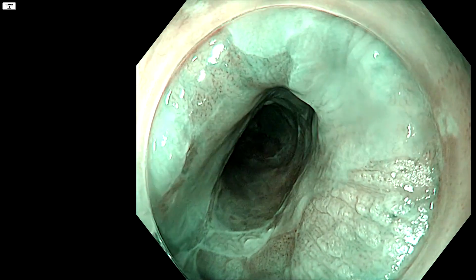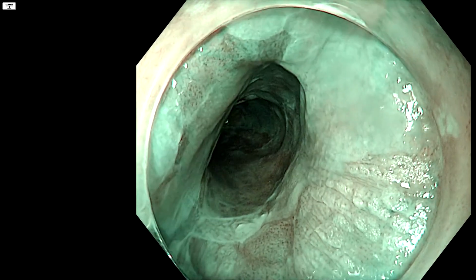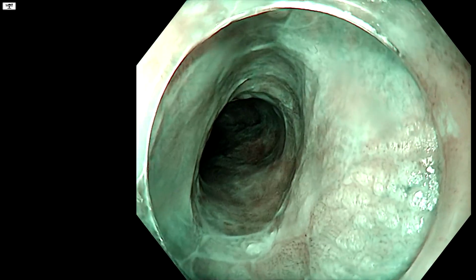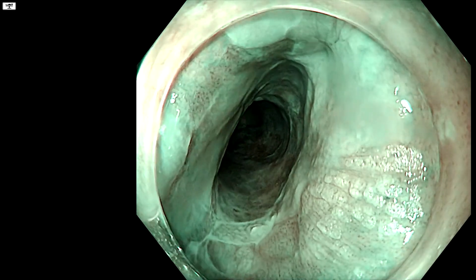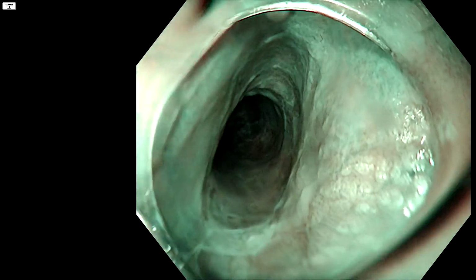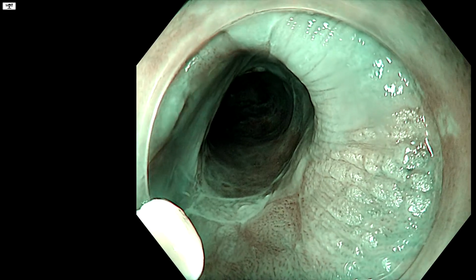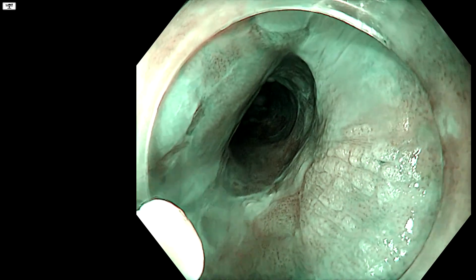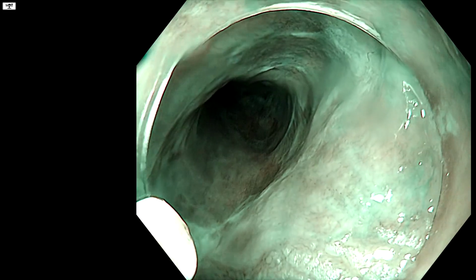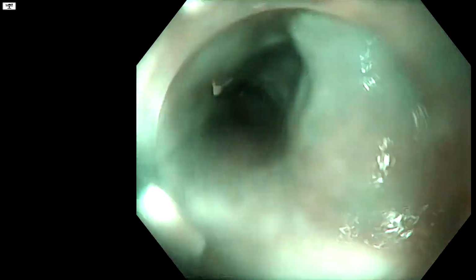One of the problems with putting on Lugol's iodine before, we're going to resect this, right? Maybe I should have said that. The problem with putting it on first is that it can become very, very difficult to mark and get your marks to work. And also, you lose information, because here I'm using 2 sources of information, whereas if I put the Lugol on first, I can't use virtual chromoendoscopy to do anything. So put out the knife, please.